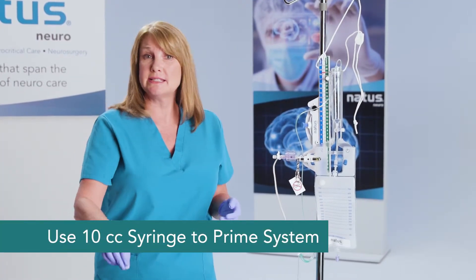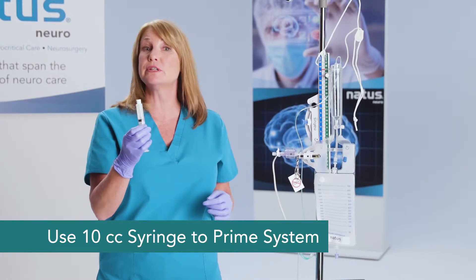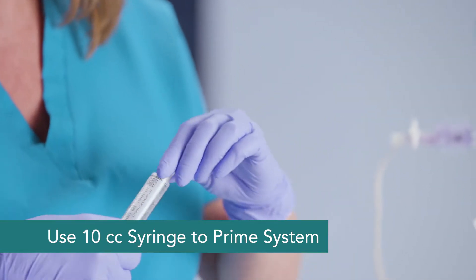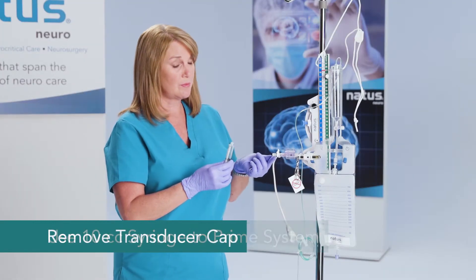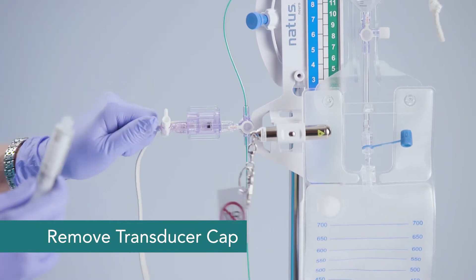You can use a 10 cc syringe, as long as it contains preservative-free sterile normal saline — this is what you'll prime the system with. I'm going to remove the cap at the end of my transducer and prime through the transducer.